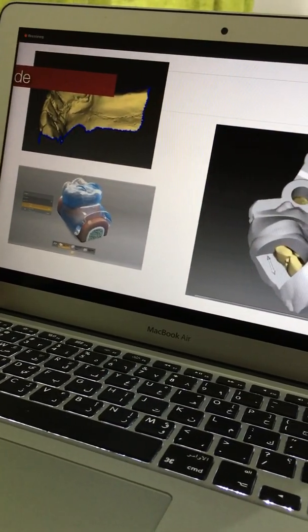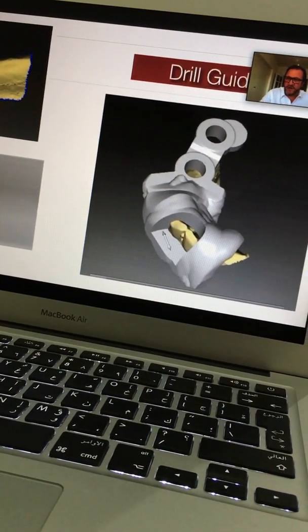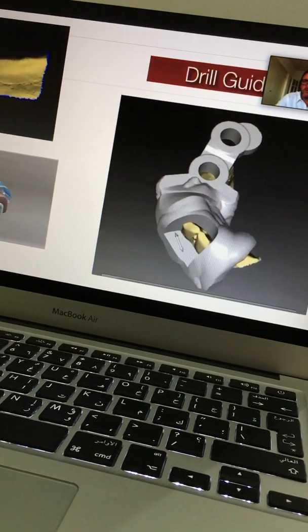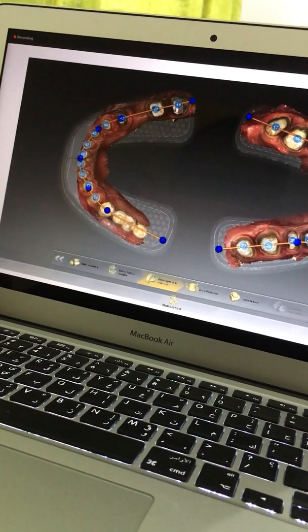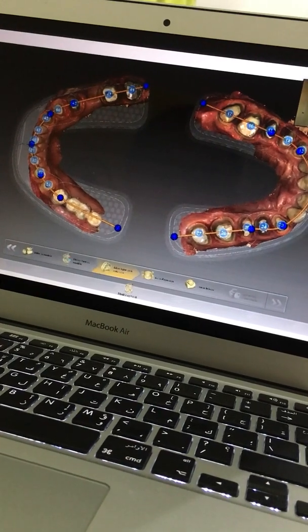All the software, Inlab software, can do all that workflow. And for me, it's very easy to use. I can use that each day without any trouble. It doesn't take too much time, and I have such a good result at the end.